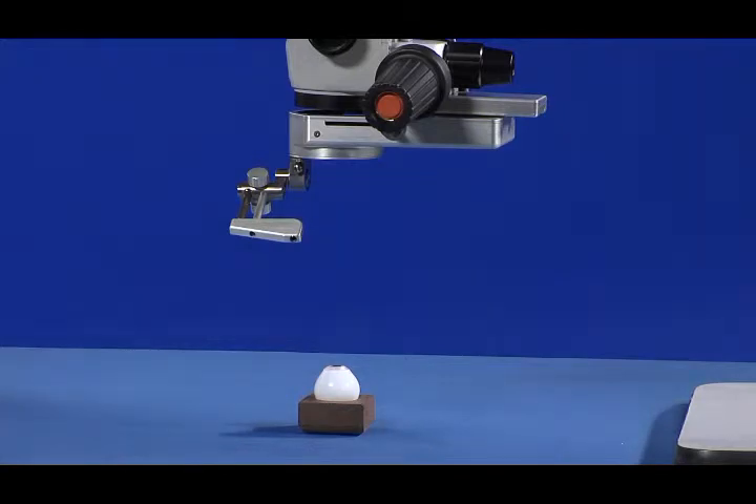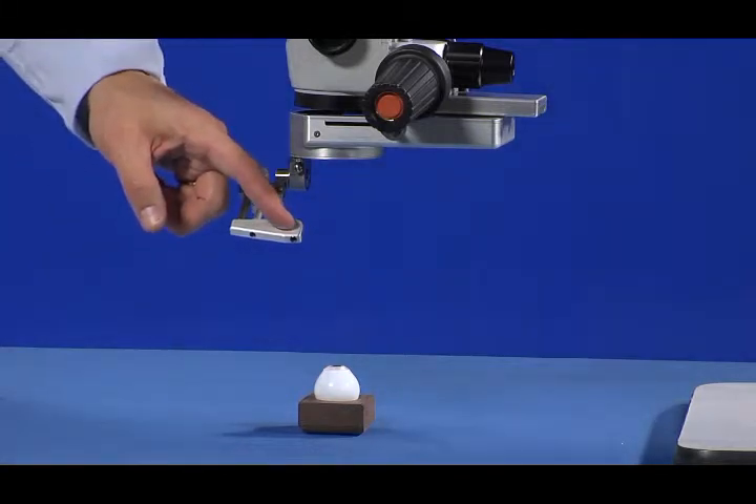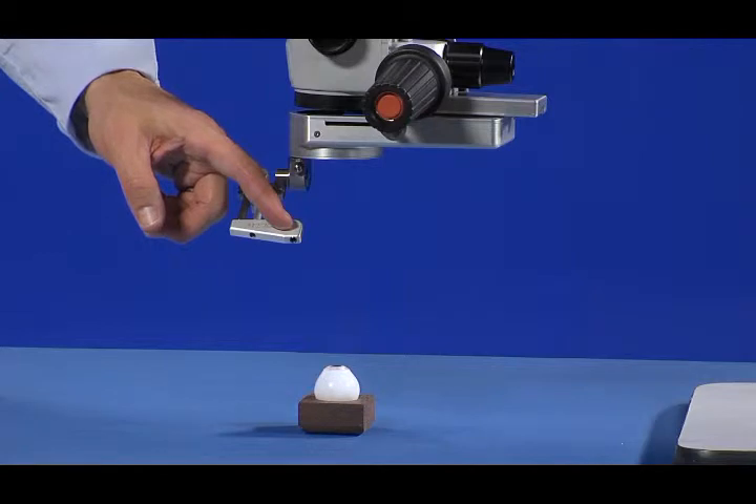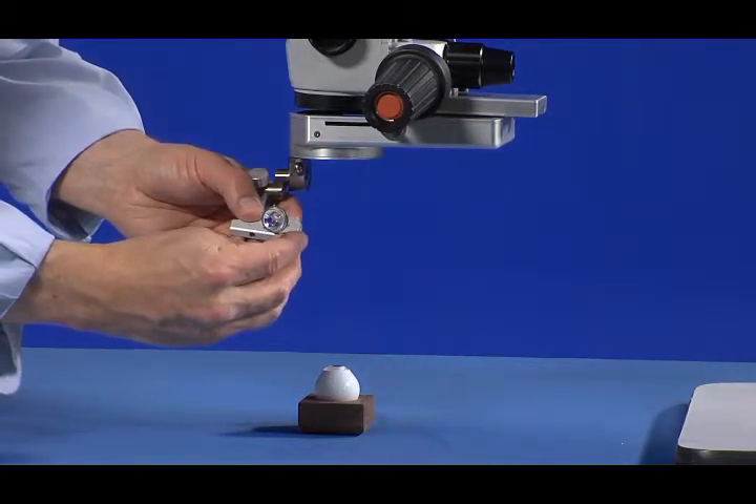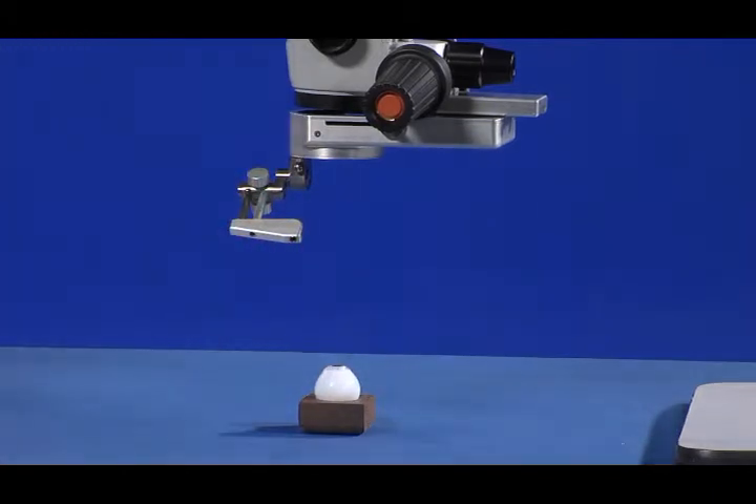The surgical lens is attached to the LPU and then suspended directly over the patient's eye when viewing the retina. All three lenses provide an inverted image of the retina that is subsequently corrected using a reinverter device, such as the Volk Rolls Infinity.